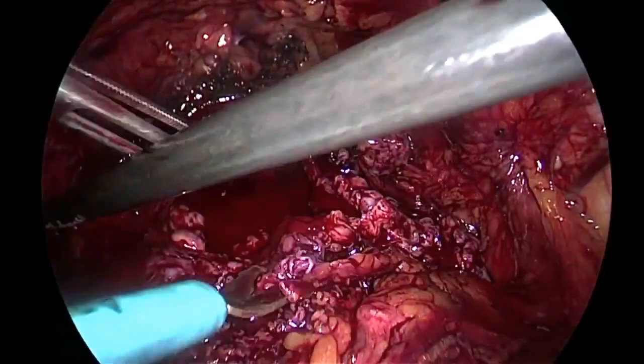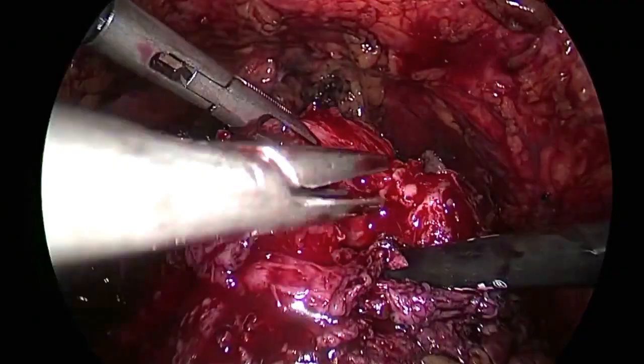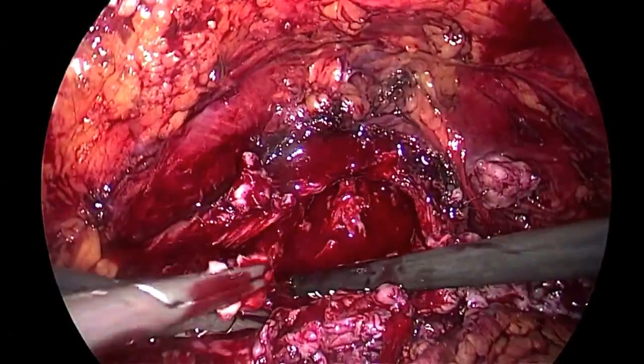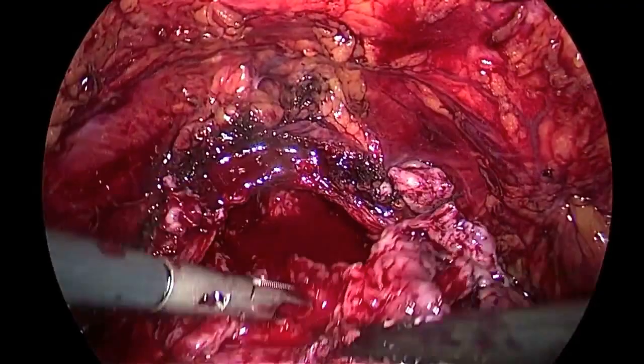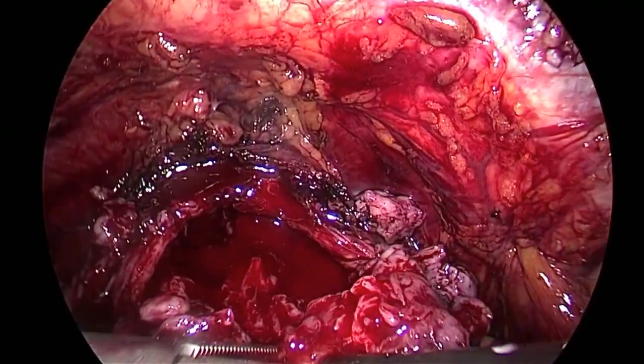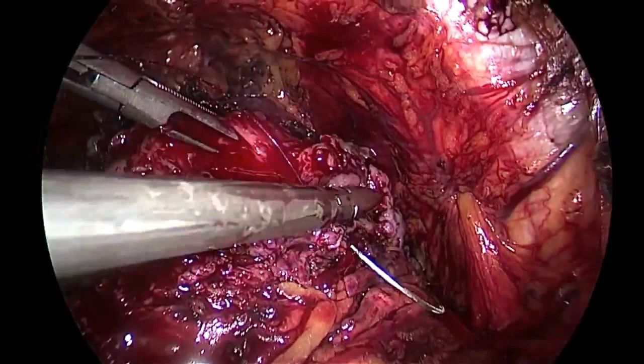So it's the bladder neck, and now I begin the suture from here, from 5 o'clock up to 7 o'clock. I perform a running suture. Give me, please, in order to obtain the typical trigonization. So it's important to perform a trigonization because thanks to the trigonization, not this one, but the 5-8.